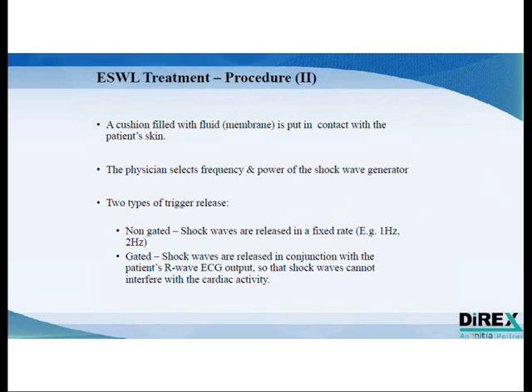As explained, the shockwave is generated inside a water medium, and because the body is mostly water, if you generate a shockwave inside a water medium and transmit it to the body, which also consists of water, then you have an almost uninterrupted energy propagation. So for this, all shockwave generators today have a shockwave source located inside a water medium, and this is allowed through the use of a membrane.